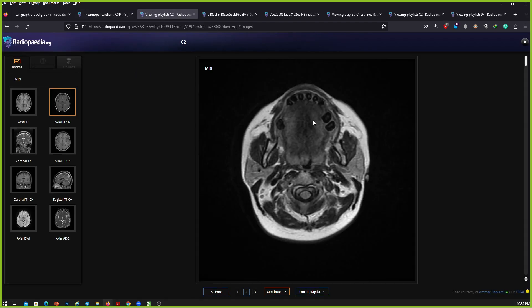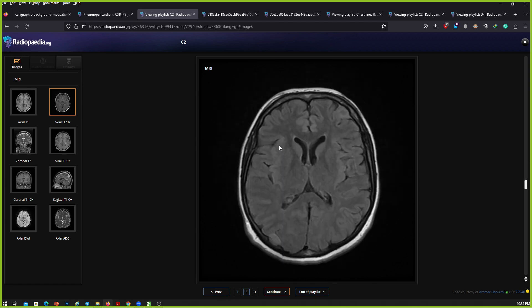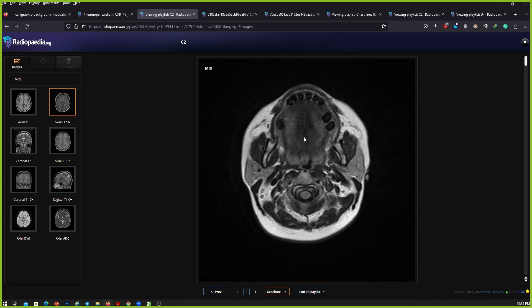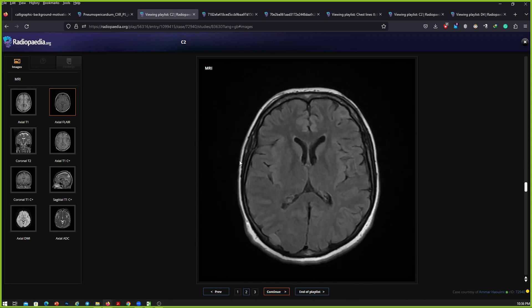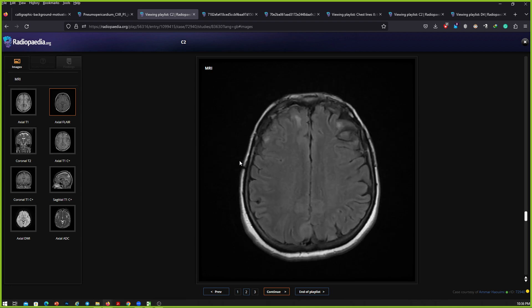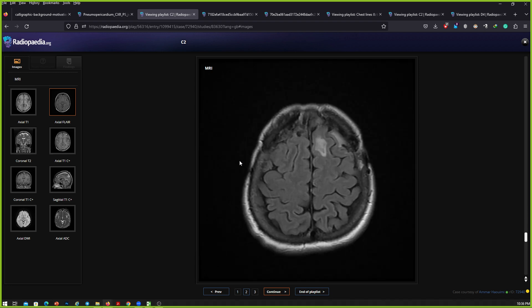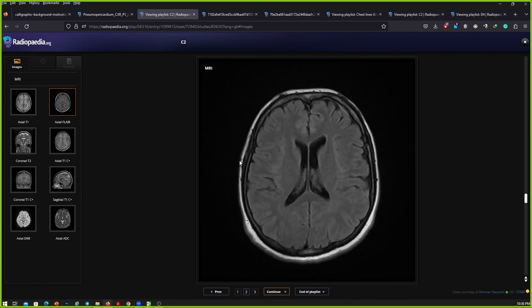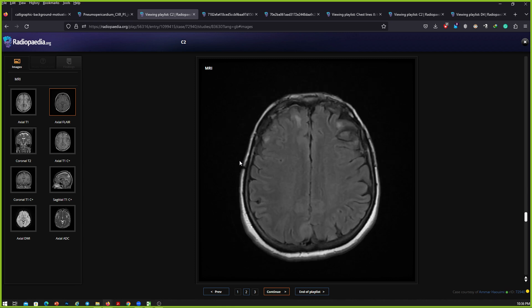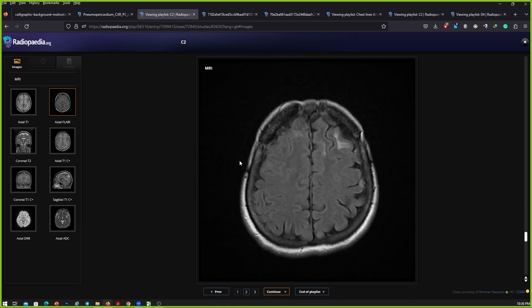Here is your next case. Please don't use the mouse — I will give you the control. This patient had recurrent headaches. Now you can scroll and describe.